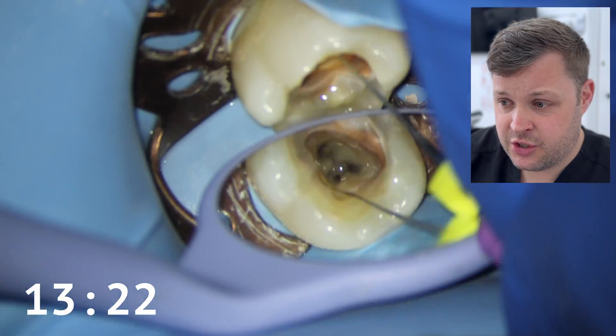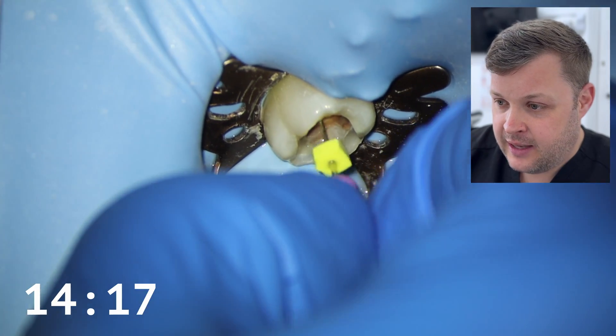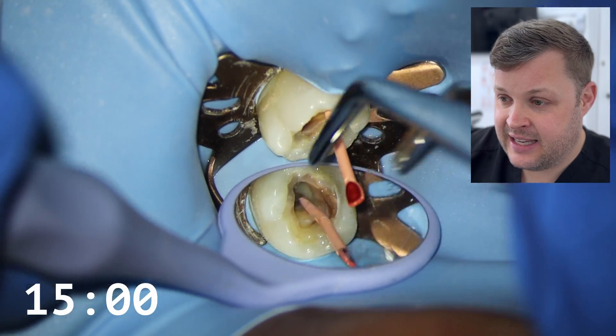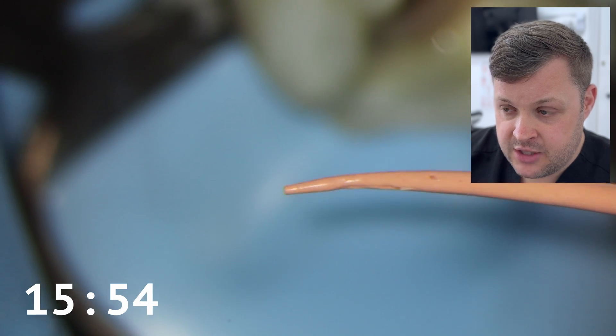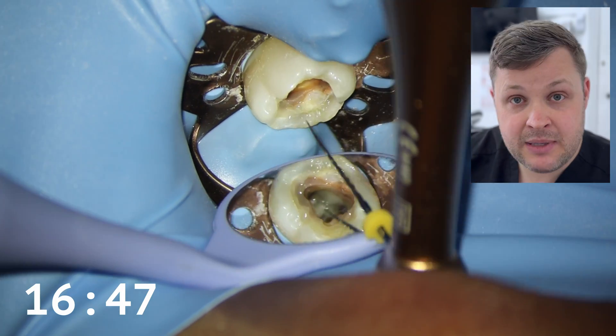I'm going to feel around for the join with my size 10 K-file and make a guesstimation of where these two canals join — you could take a CBCT, by the way. The technique I'm going to use is to put a GP point in the main canal (the ML), then place a size 10 K-file in the MB — the secondary canal we think joins onto the ML — and mark the GP point. You can see we've made a mark in the GP point with our size 10 K-file. This is great because we know the two canals join, and we now know the MB is shaped. We're 16 minutes in and we've shaped two really difficult canals.